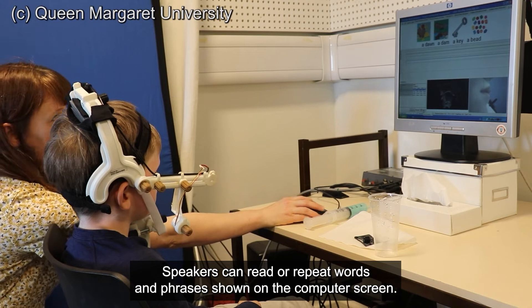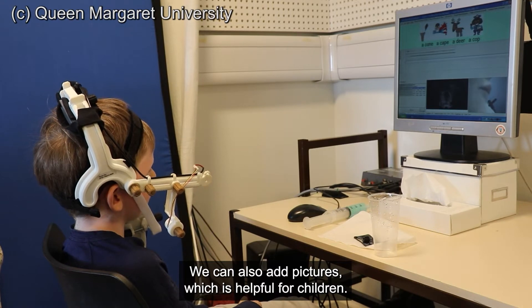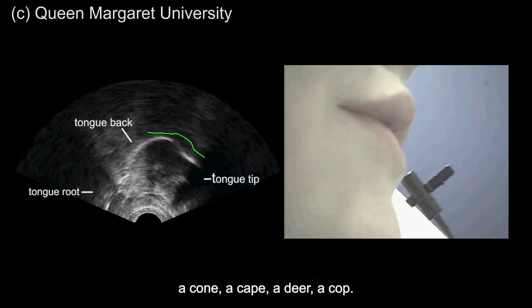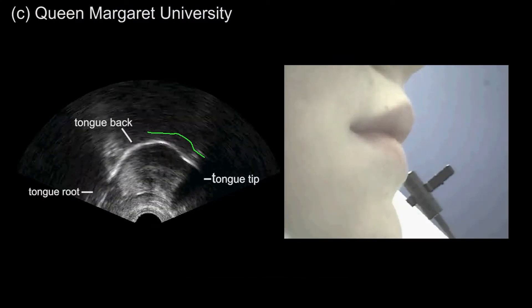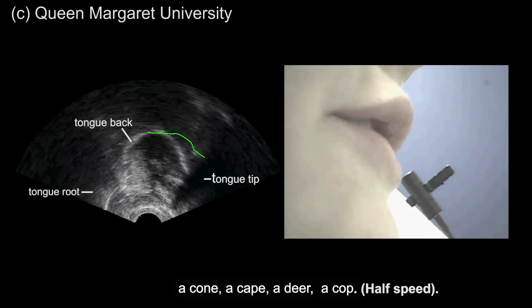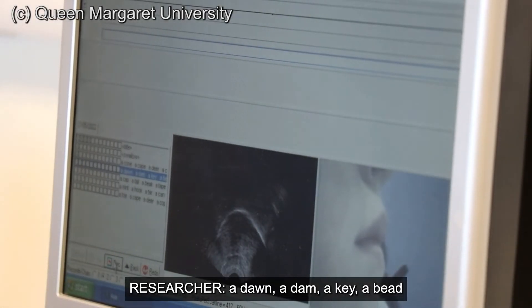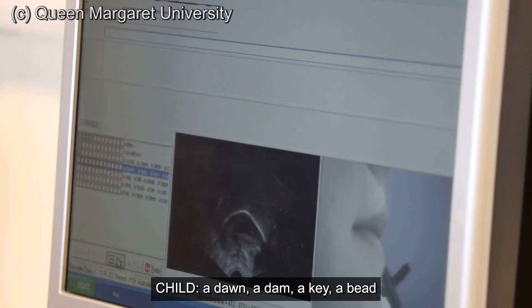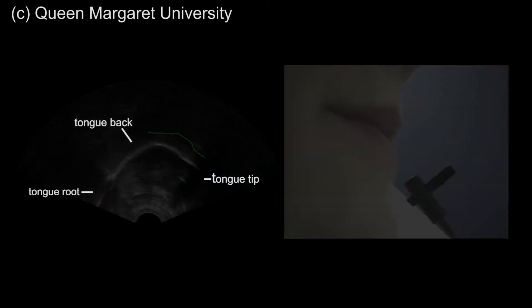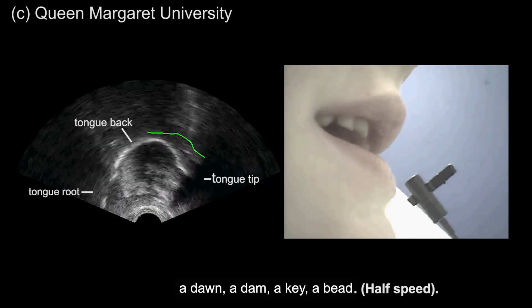Speakers can read or repeat words and phrases shown on the computer screen. We can also add pictures, which is helpful for children. Example words recorded include: a coon, a kate, a dire, a cop, a don, a dam, a kate, a bead.